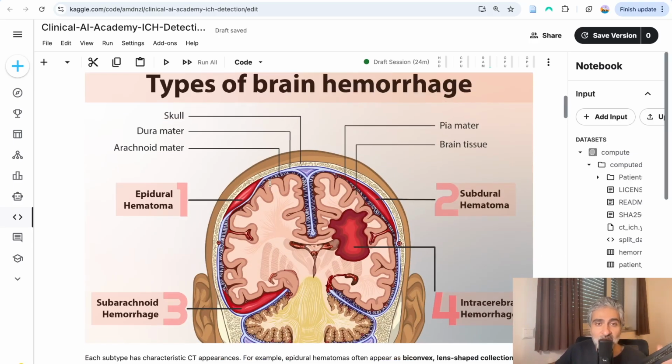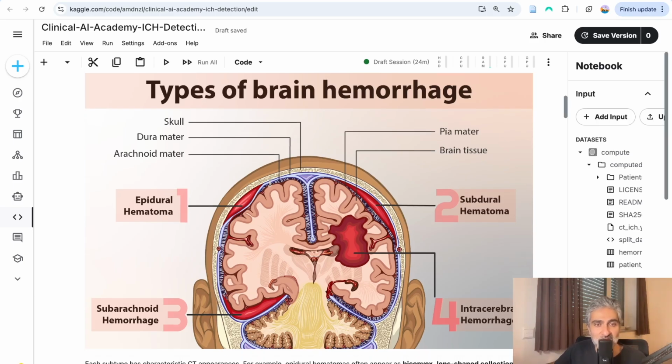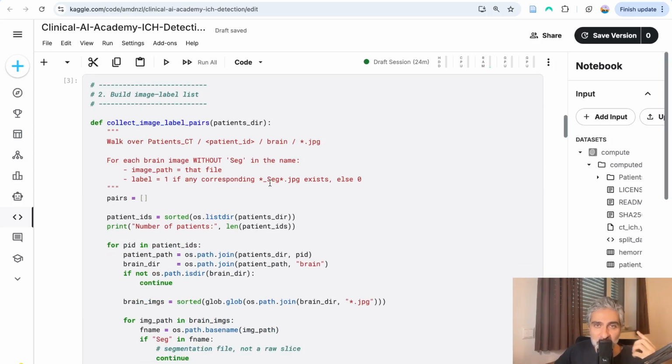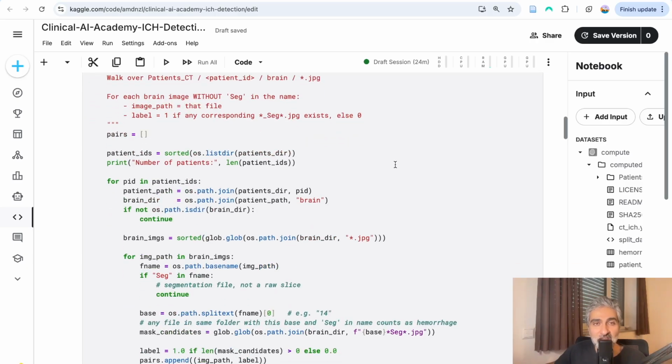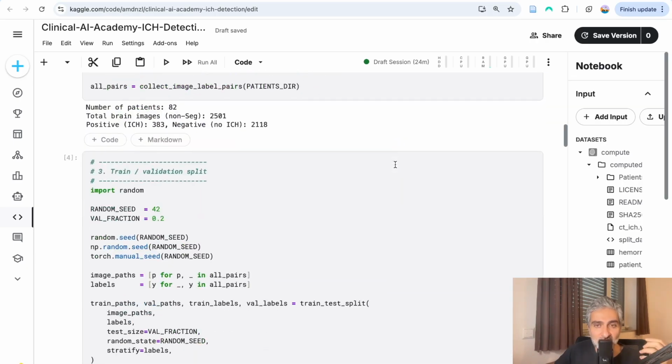You have seen that sometimes I faced errors. What would I do? I would take that error and just ask Google or ChatGPT about it and see what to do about it. Sometimes I knew what to do, but I needed to make sense of it. Also, coding should not be the obstacle. Just having the idea and going through Kaggle, getting familiar with these data sets. I personally found the most daunting task is loading the data set and pre-processing it, and then other things you can find out and you can build and you can understand and so on.